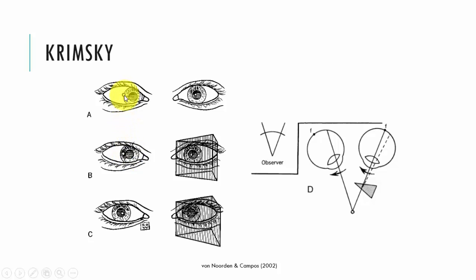And we can see that it was here on the margin of the iris with no prism, and now with the base out prism it's getting closer to the pupil, and then the orthoptist has found the correct prism to bring it into the centralised position or slightly nasal where we're expecting it. And what we're really expecting is that the position of the corneal reflection in the deviating eye should be the position of the left eye before you began testing. Okay? So when you begin your testing, see where the corneal reflection of the fixing eye is, and then you're trying to simulate that in the other eye.